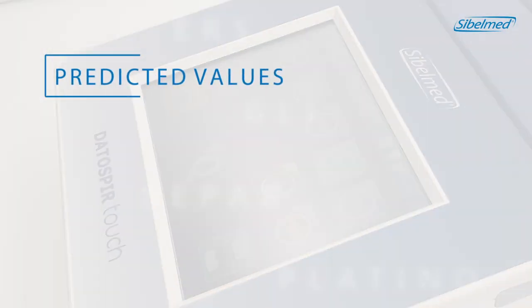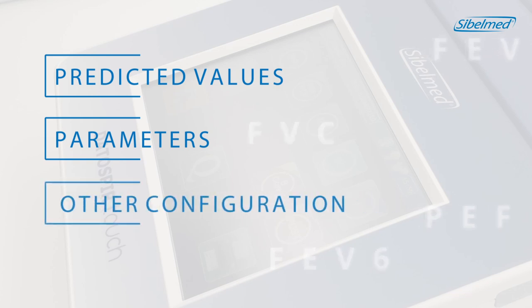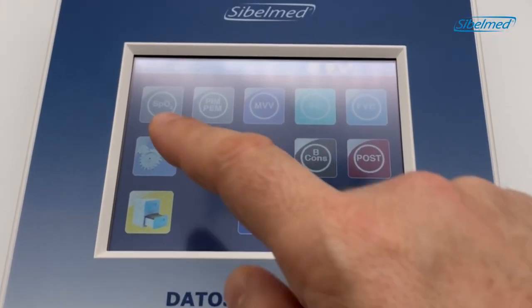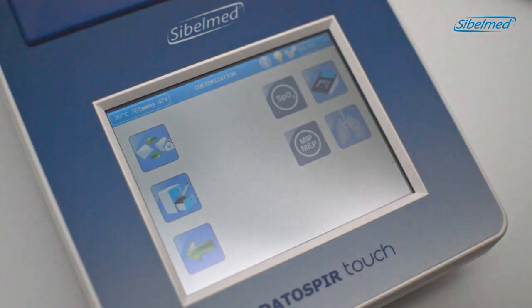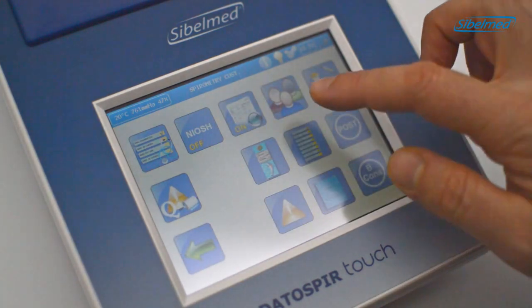Before the first spirometry test, we recommend configuring some general parameters: the predicted values, the spirometric parameters of each test, and other settings such as interpretation, printing graphics, or incentives. Click on the configuration icon on the left side of the screen, then click on the customization options. The menu will show different options, but we will focus on the right side, selecting the lungs icon. It will allow us to customize the reference values, parameters, incentive, etc.